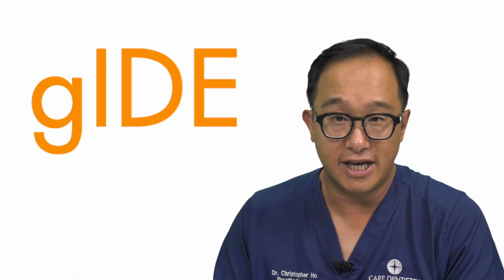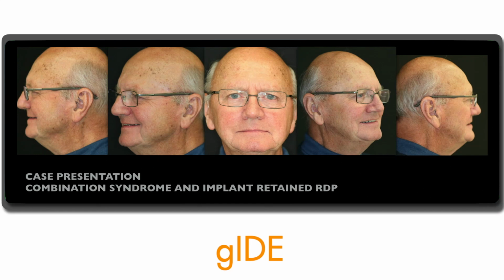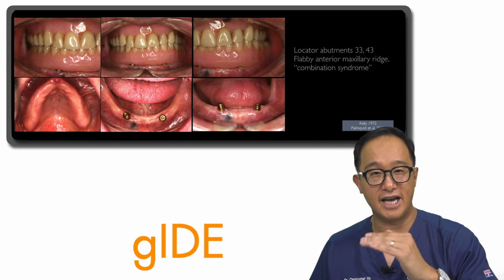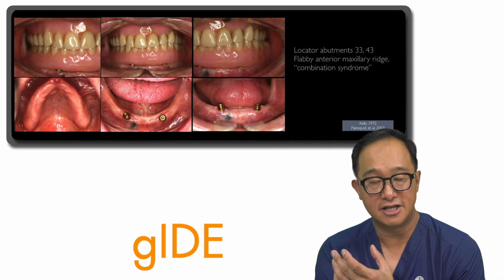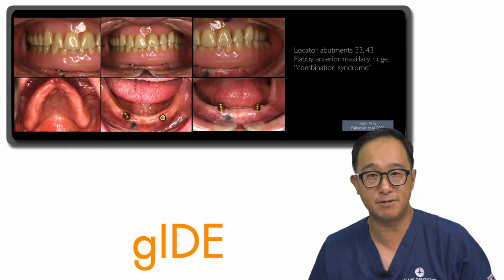So I'm going to show you a case of how we use the locator attachments with an overdenture. This patient came in unhappy with his implant prosthesis, but he had combination syndrome with the flabby maxillary anterior ridge. As the patient occluded, the prosthesis tended to rotate, and they found that their prosthesis in the mandible disengaged from the locator attachments because there was so much movement of the maxillary complete denture.